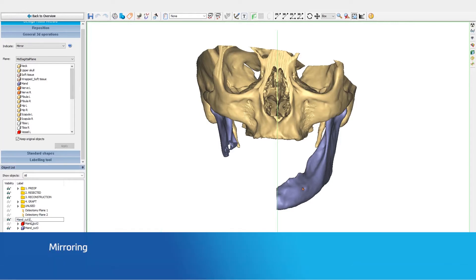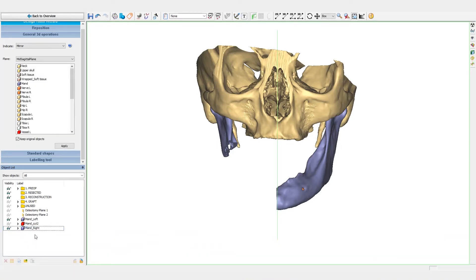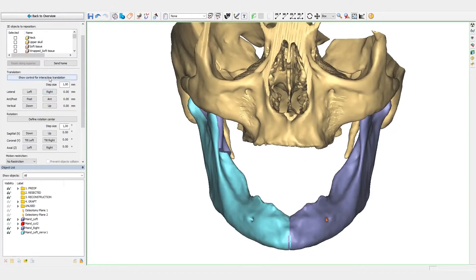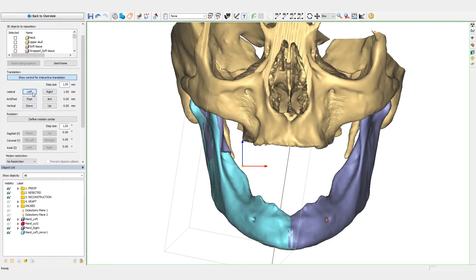Now that we've simulated the resection, we will mirror the healthy side of the mandible to the contralateral side by using the mid-sagittal plane. In a final step, the position of the mirrored mandible can be fine-tuned taking into account the position of the condyles and the information in the CT images.